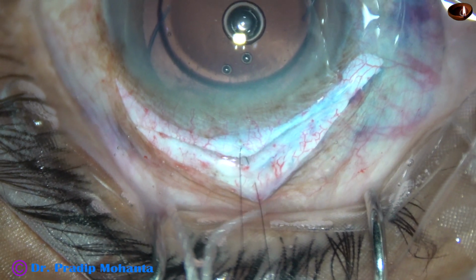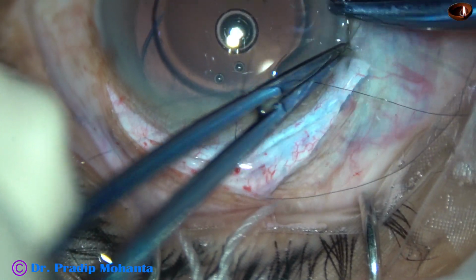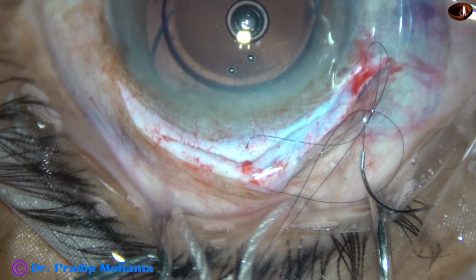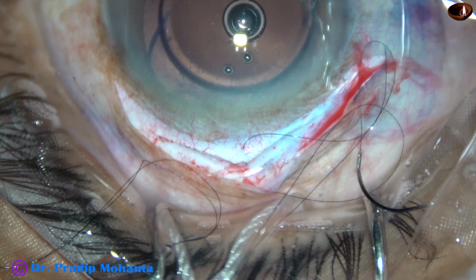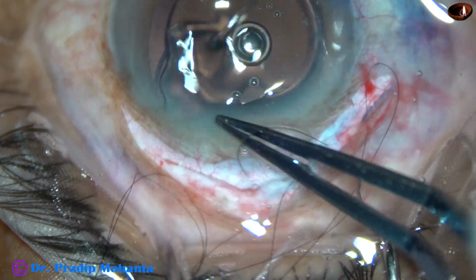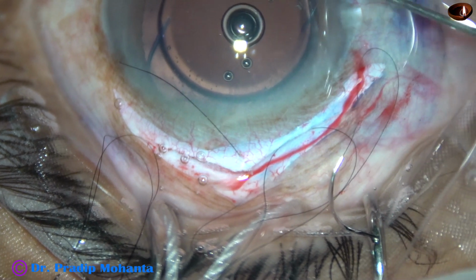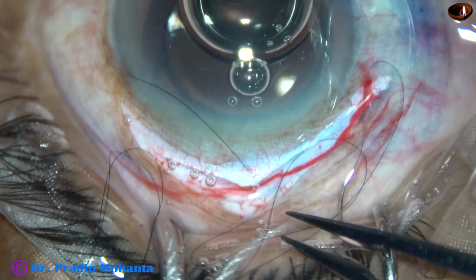Now before tying, I want the intraocular pressure a little more. This conjunctival peritomy is to be opposed by this suture, and this will be a releasable suture. Before tying the sclerocorneal suture, I'm going to inject an air bubble in the anterior chamber, because the intraocular pressure should be almost normal when I tie this suture. Instead of injecting visco, I injected an air bubble.